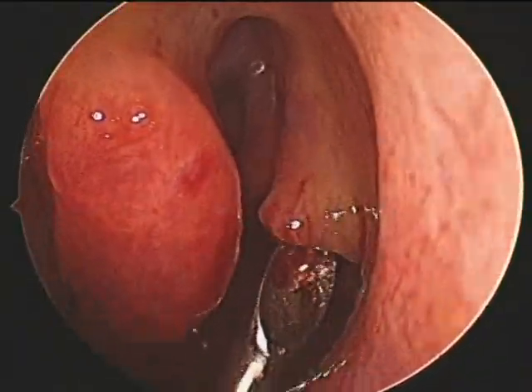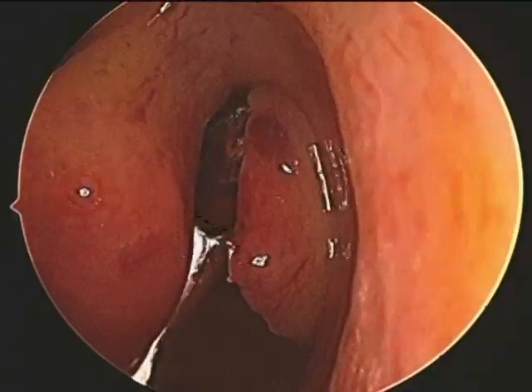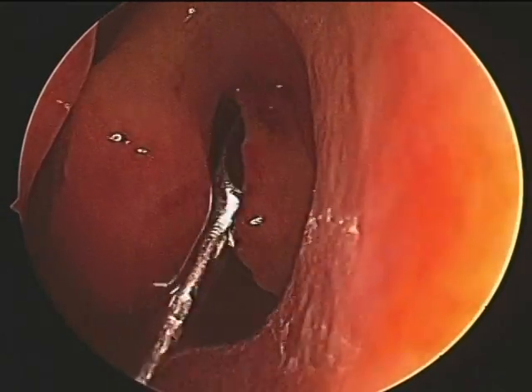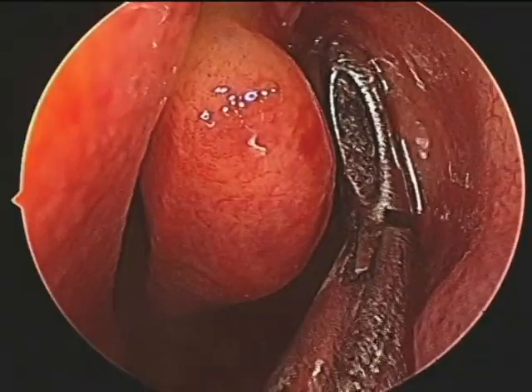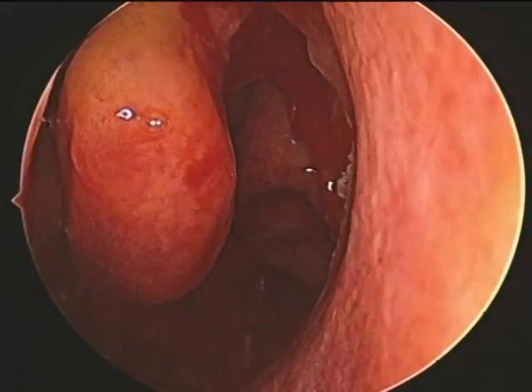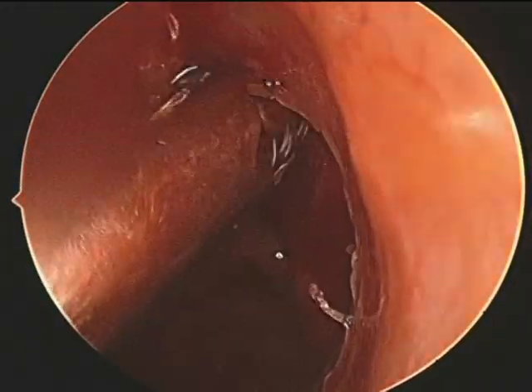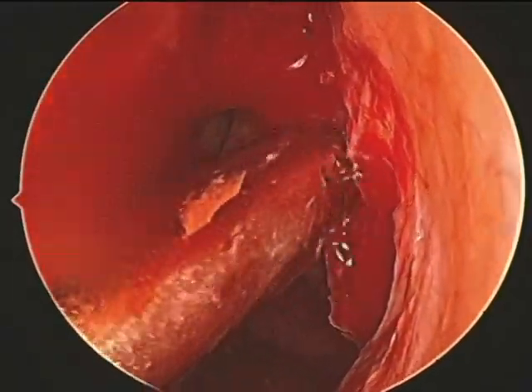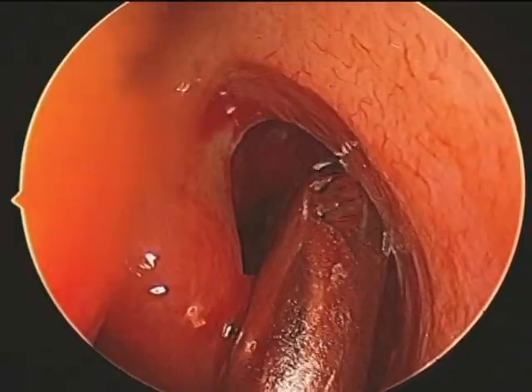We use a 45-degree spoon curette, then a 45-degree Blakesley forceps to address the vertical portion of the uncinate process. We use a RAD 40 microdebrider blade to define the region of the lamina papyracea. It is always important to identify the lamina papyracea at the beginning of surgery so that you can avoid injury or perforation.